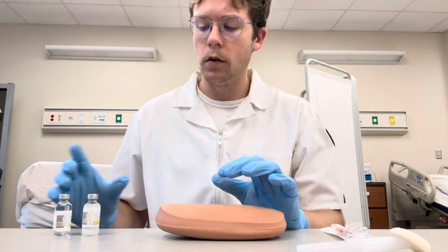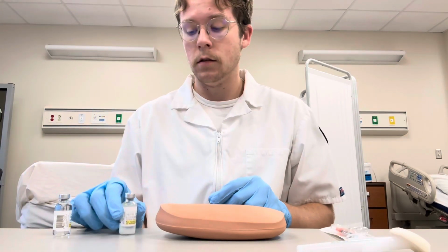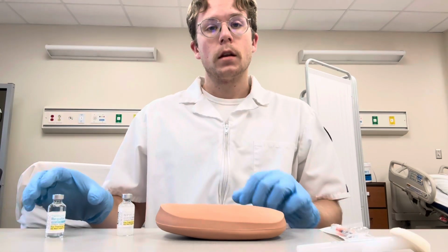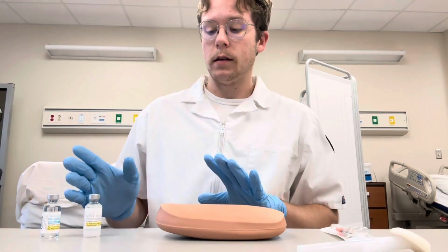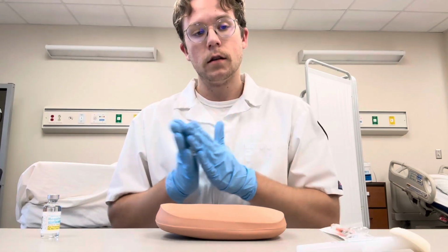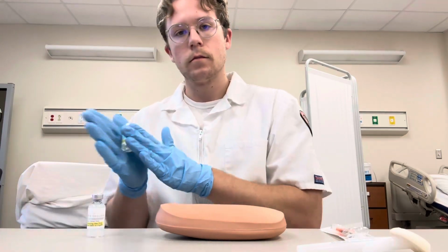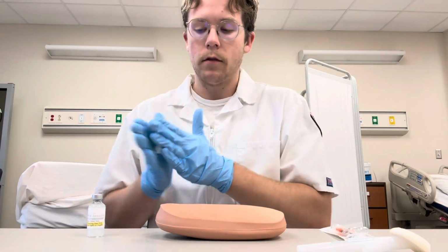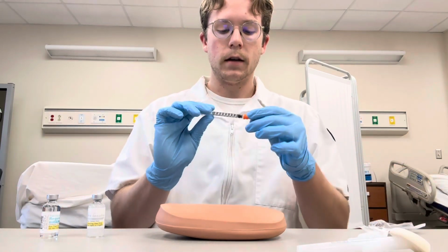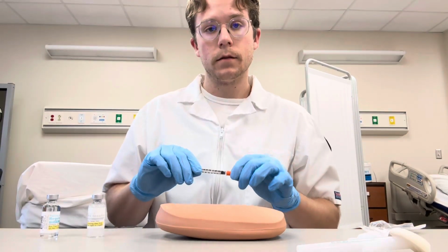All right, so we pulled our medications. We have NPH, we're going to do 16 units, and regular insulin, we're going to do 6. And we'll check the expiration date of our vials, and we'll also roll our vials to make sure they're mixed thoroughly. All right, and we have our insulin syringe here. Insulin syringes are easy to identify because they use units instead of normal milliliters.